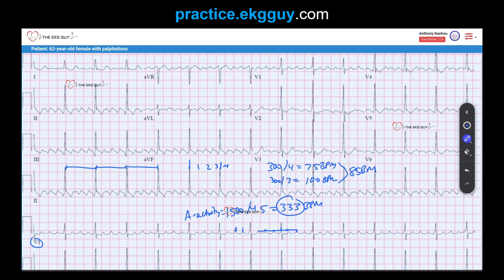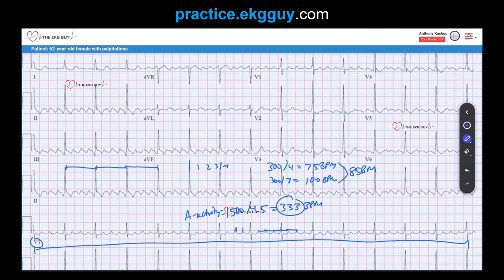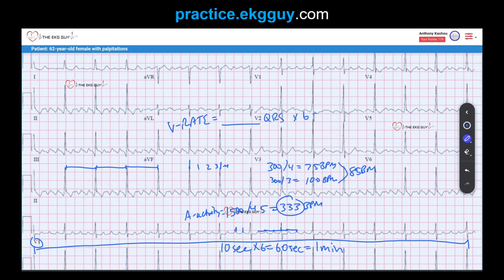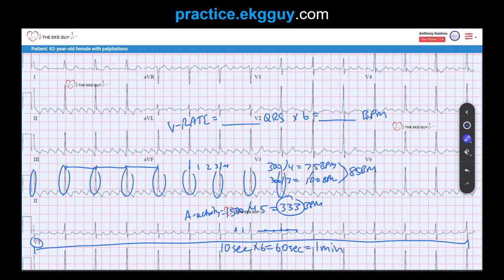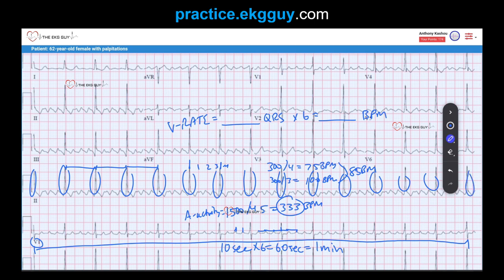Another method: the standard 12-lead ECG spans 10 seconds, and 10 times 6 equals 60 seconds — one minute. So you can count the ventricular complexes in the strip and multiply by 6 to estimate the ventricular rate. Counting the QRS complexes: 1, 2, 3, 4, 5, 6, 7, 8, 9, 10, 11, 12, 13, 14 — and there's also a 15th one. So 15 QRS complexes times 6 equals 90 beats per minute, close to the 85 reported.